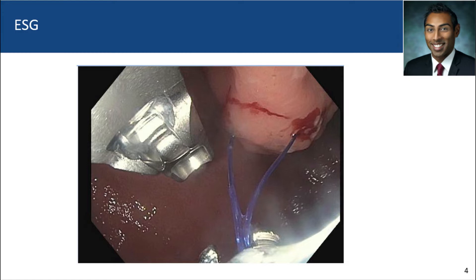This is a picture of what the Apollo OverStitch suturing system looks like when attached to a double-channel therapeutic gastroscope. Suturing can also be performed with a single-channel gastroscope. This is an image of a full-thickness bite, and if you look at the point of insertion and point of exit of that suture, you can see there's a nice distance — and the larger the distance, the more it likely translates to a deeper bite.